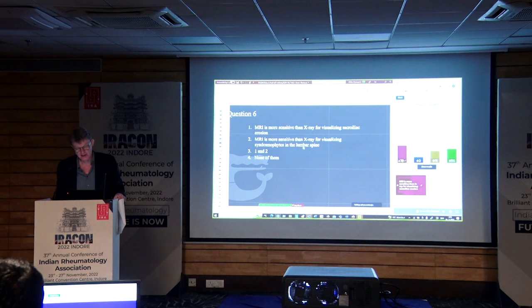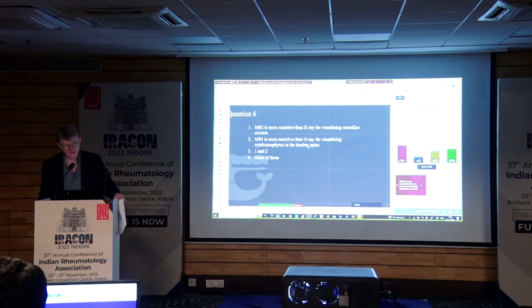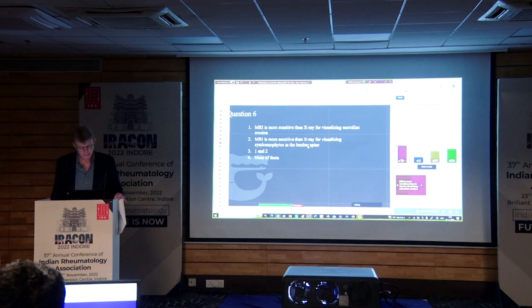I specifically said lumbar spine because that's where radiographs are best. And I would say that it's much easier to look at it on X-rays. CT is the best. And there are some new sequences which we are working with, that others are also working with, where it actually makes CT-like MR images, which I think will solve this issue, but so far the standard sequences, it's not the strength.